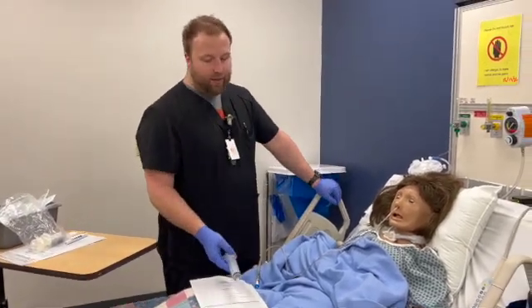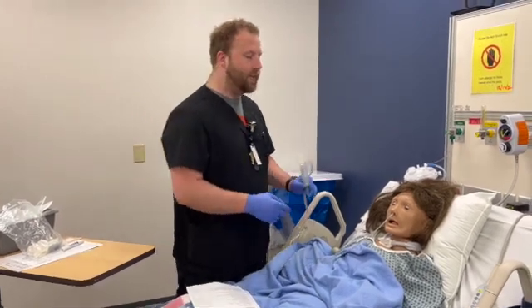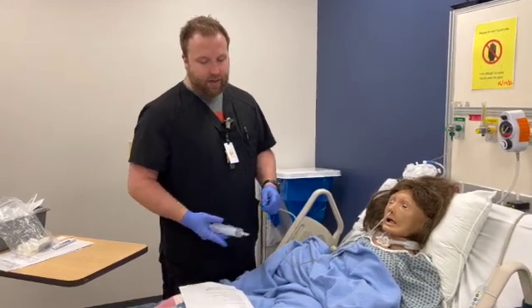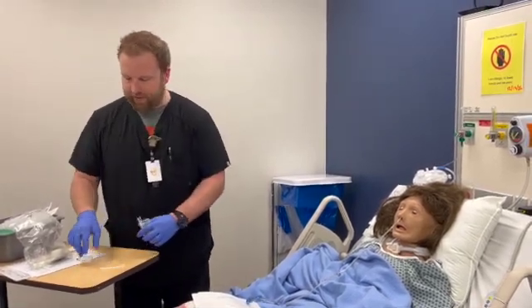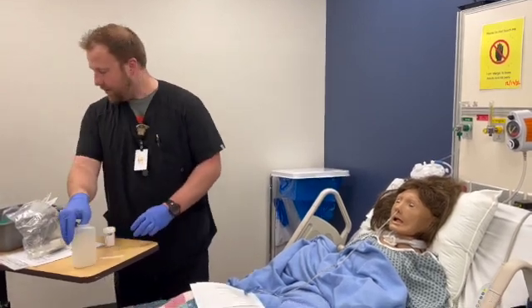placement. Now make sure that when you're putting in the tube that we're not forcing the insertion. If you meet a lot of resistance, pull back out and retry. You may need to switch nostrils. I want to have my pH strips ready. I have these on the table here.